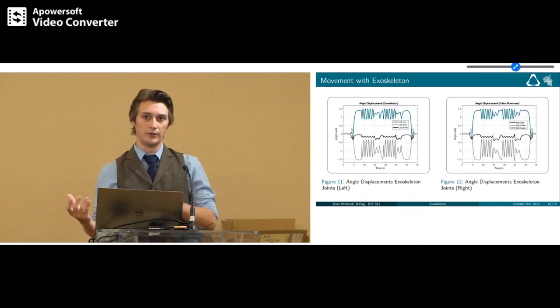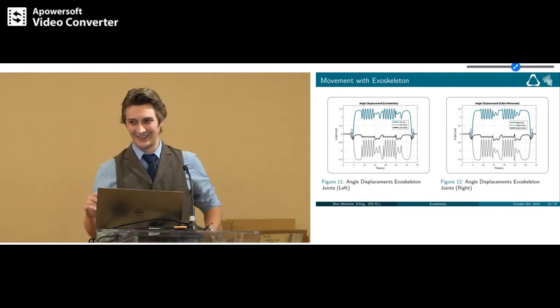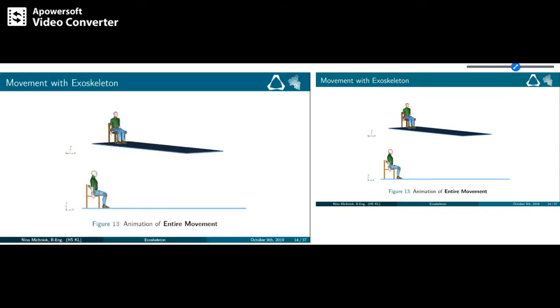So what I wanted to do then was adding the flexible bodies, and that caused a lot of troubles and errors, and the runtime went to infinity. So I had to take a step backward to refine the model to make it more robust. And the first thing I had to do was to adjust the contact method, because I had used the Poisson method at that time. And one of the Altair engineers told me it's more convenient to use the impact model for the continuous contacts which I had, because at least one of the feet was always in contact with the ground.